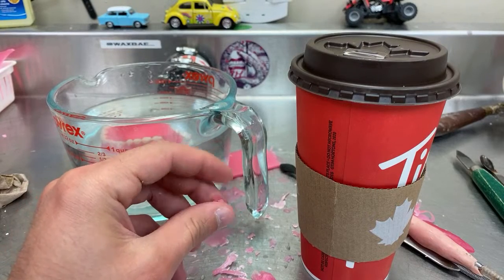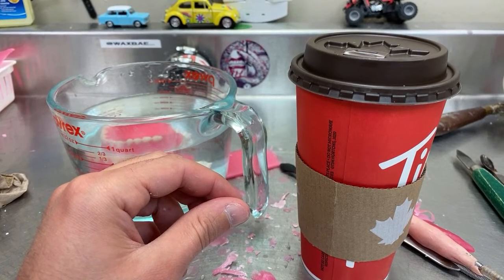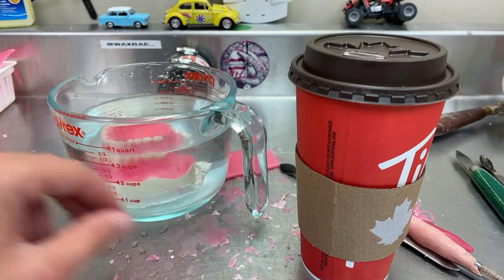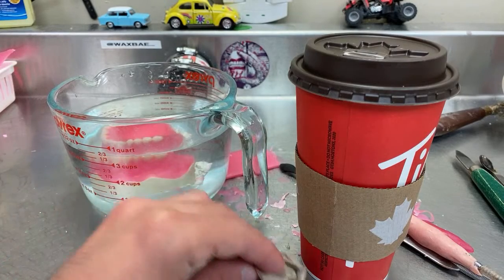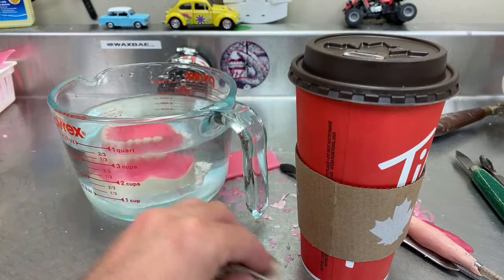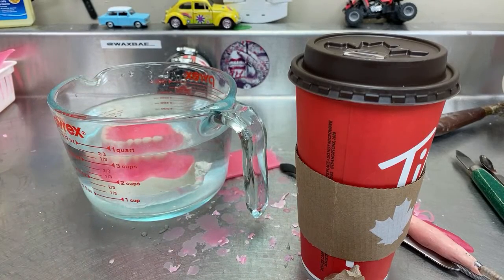I guess you use the wax as a base plate. If yes, why not use acrylic? I don't like using acrylic. I've said it on many occasions because it takes longer to prepare, polish, trim and cure, and it also takes some of the thickness, and I'll have to trim the teeth shorter, and I don't like to do that. So we use hard wax as a base plate, and it works great.